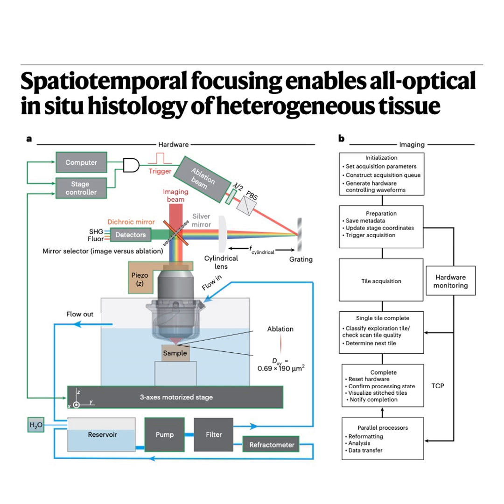So they had to engineer a solution, and it was quite clever. A miniature, high-speed, closed-loop flow system. Like a little plumbing system built right into the microscope stage. Pretty much. A sophisticated microfluidic system designed specifically to constantly flush the area right under the objective lens. It washes away those laser-induced cavitation bubbles and any little bits of sample debris immediately as they form, keeping the optical path clear for continuous operation. Very neat. It was essential for enabling long autonomous runs. Okay, so the bubbles are handled by the flow system.